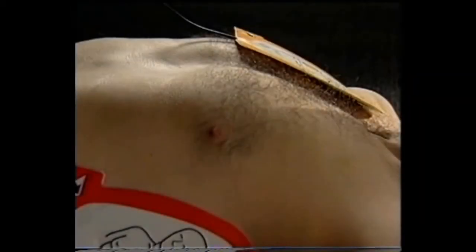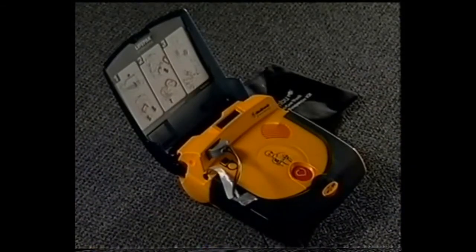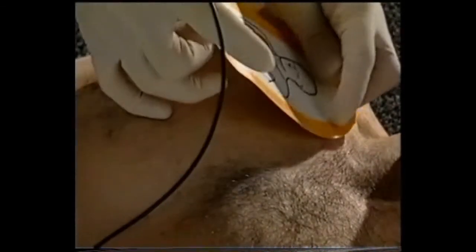If a patient has a lot of chest hair, the electrode pads will not have good contact with the skin. The defibrillator will continue to say, "Peel each pad off blue plastic." In this situation, you must first remove as much hair as necessary to allow space for the pad. Then press the pad firmly onto the skin.